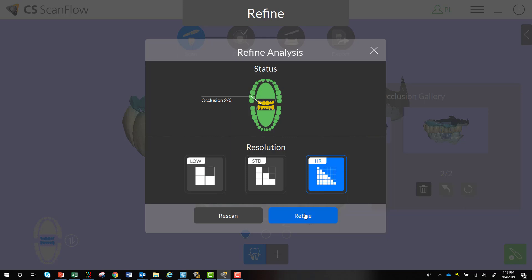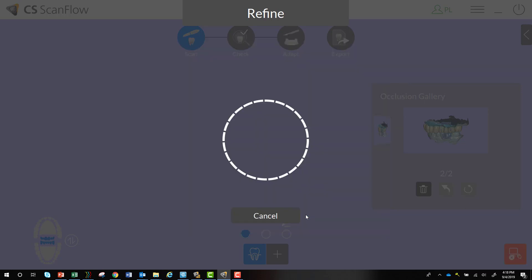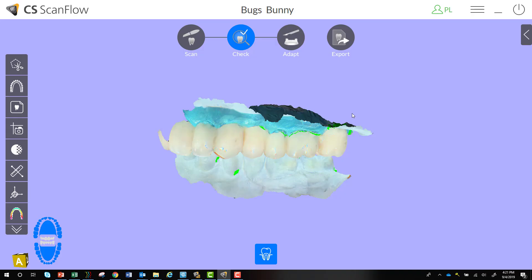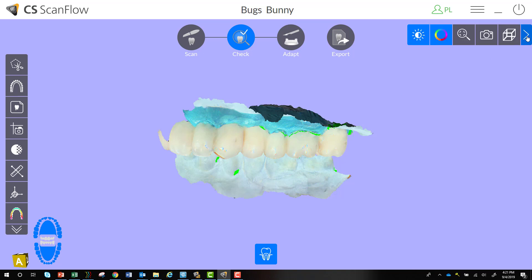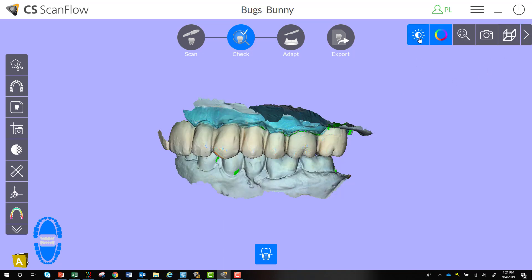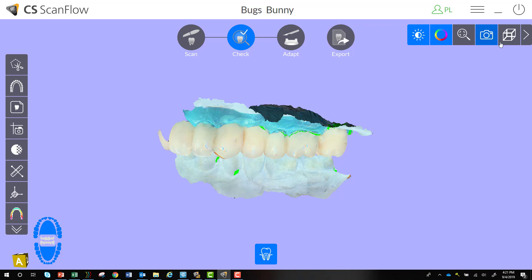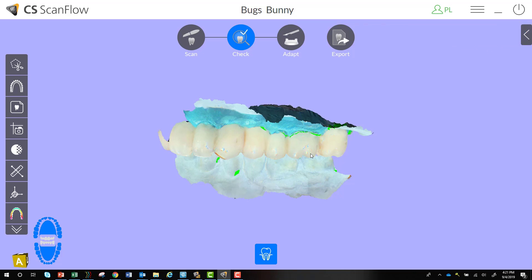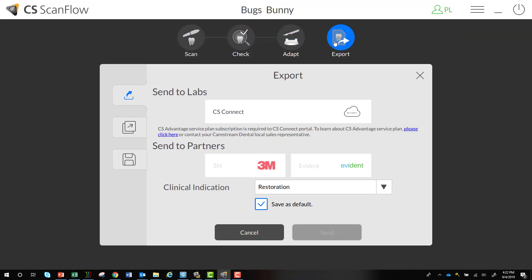Now we're refined, and the different color options to view the scan are located with this little arrow — you can select contrasted color mode or monochromatic mode. Other features will be covered in a different video. Once that looks good, you can go right to Export. Under Adapt there are additional tools I'll cover separately, but you can go right to exporting or saving the scan.